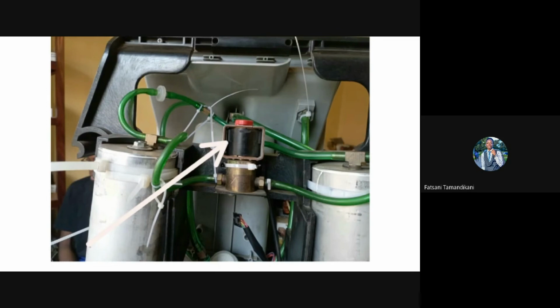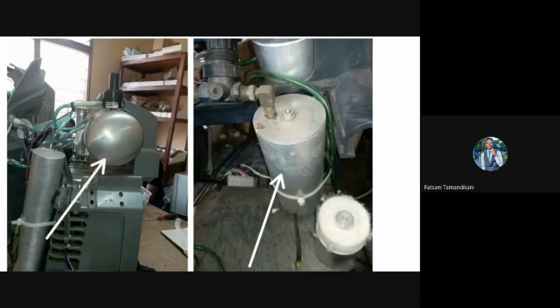So the other pressure that you can find in an oxygen concentrator is the product tank pressure. The product tank acts as an intermediary tank, and it allows the oxygen from the sieve beds to mix up inside of it.